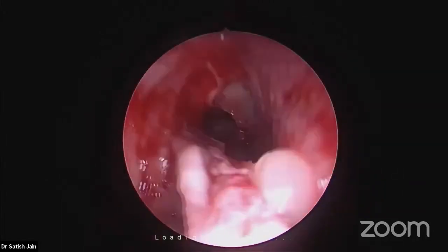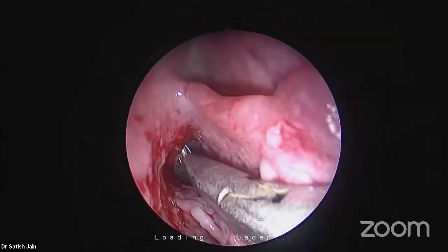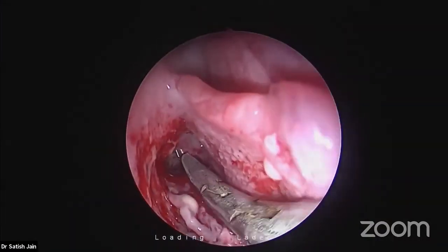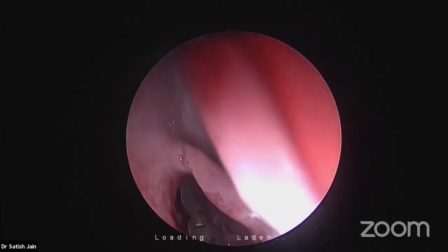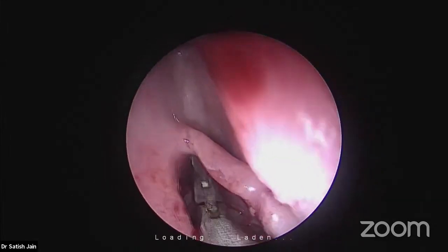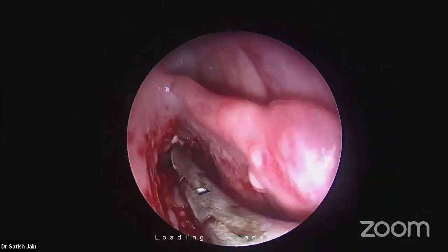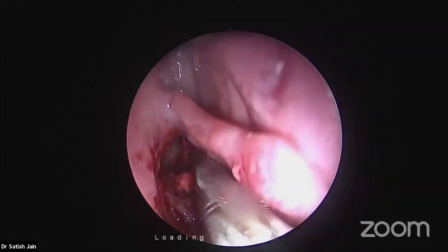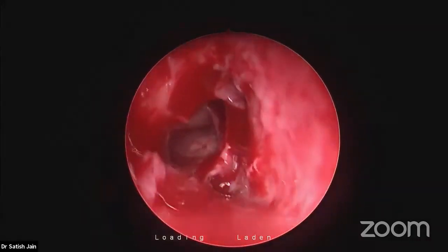Number one. Now I can enlarge this beak with a special instrument. I love this instrument. This is a Satish special. Sir, so nicely you have given the point. We have been working for many years for inventing always a different instrument for frontal sinus approaches. See now, what more frontal is coming in the way.